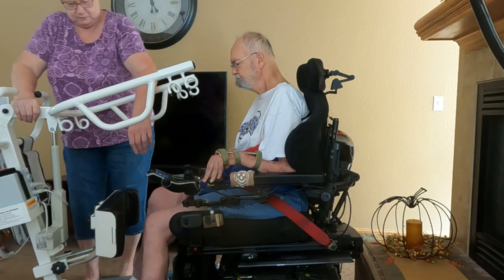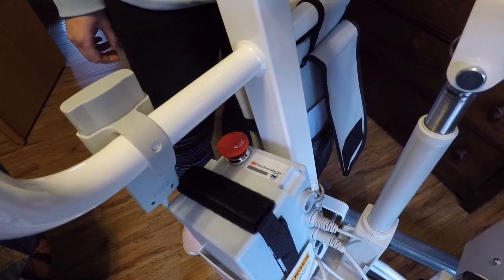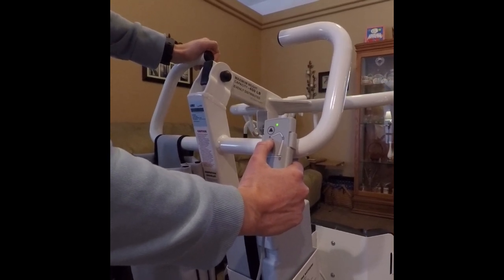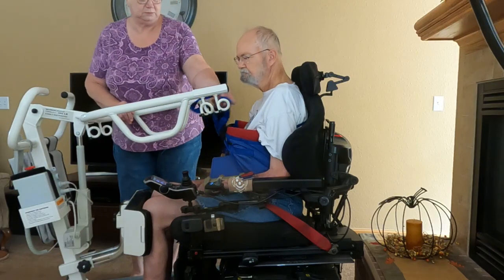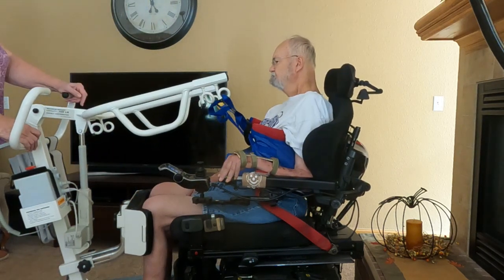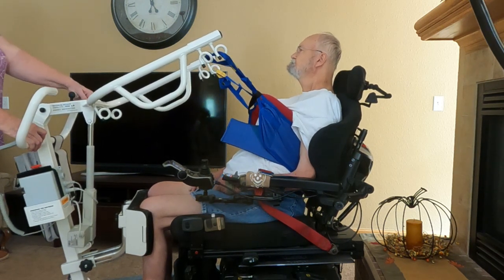When the knee rest is against the patient's knees, the caregiver needs to turn the lift power to the on position so that the lift arm can be lowered to reach the appropriate loops on the sling. Attach the sling loops to the hooks on the lift arm. Make sure to connect the same loop from both sides of the sling onto the same hooks on the lift arm. The caregiver can now proceed to raise the lift arm by pressing the up button on the control pendant.